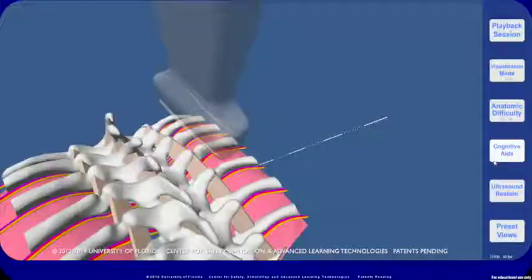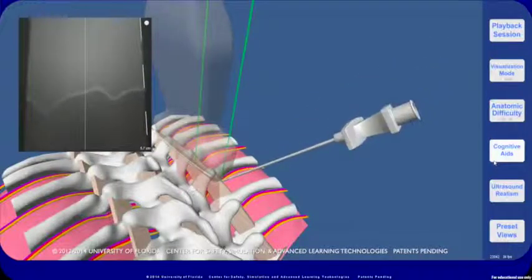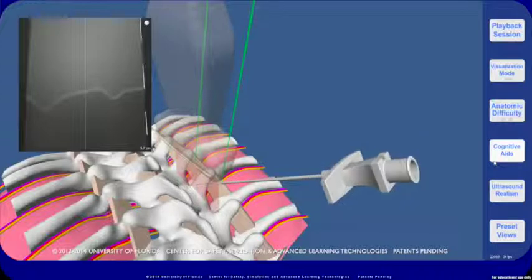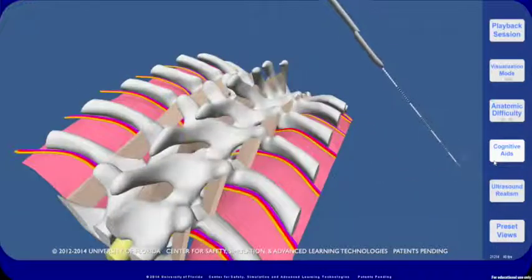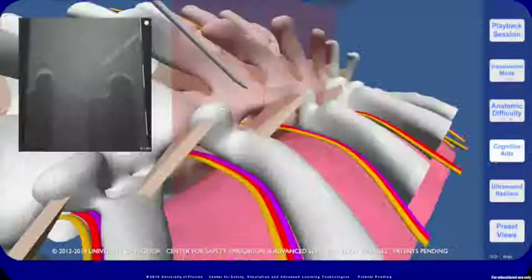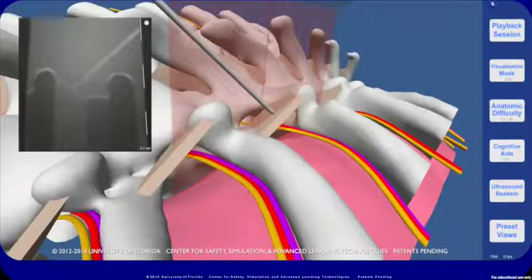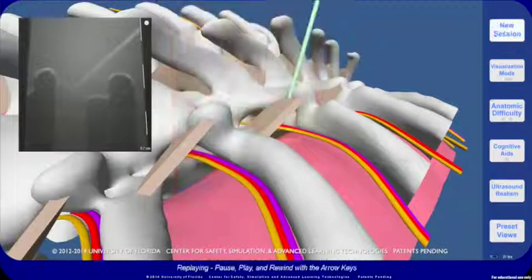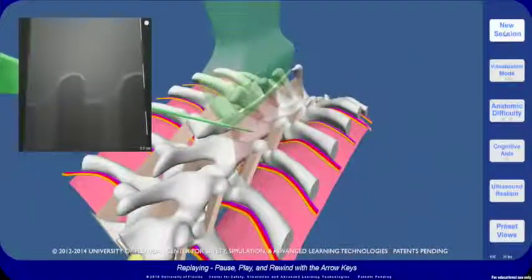Cognitive aids include perpendicularity guides to skin for both the ultrasound probe and needle. A projected target line with measuring tool can be used to show needle trajectory. The simulator can replay and score sessions. Scores are based on time, anatomical structures punctured, ultrasound technique, and proximity to no-go areas.